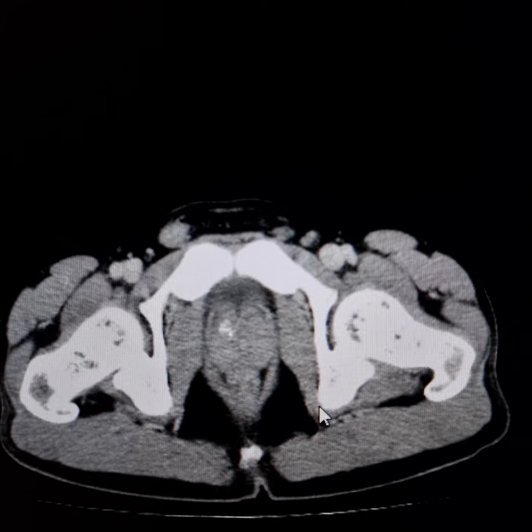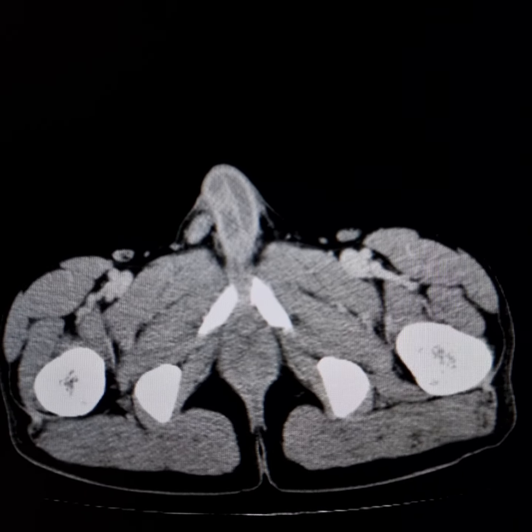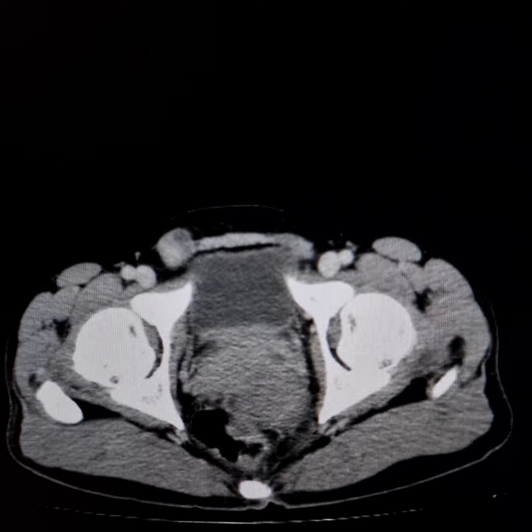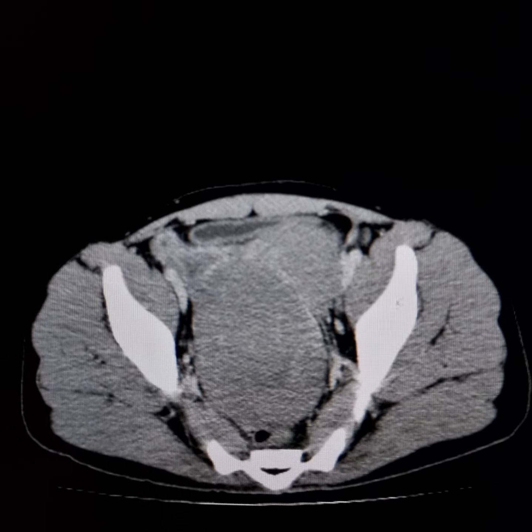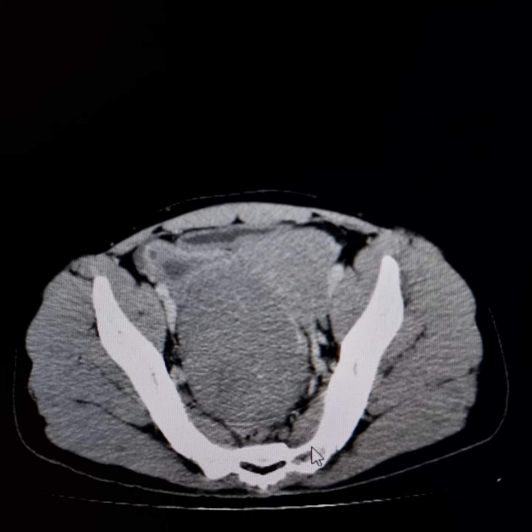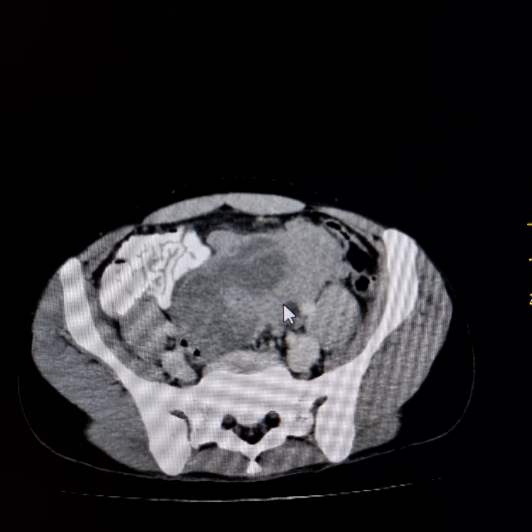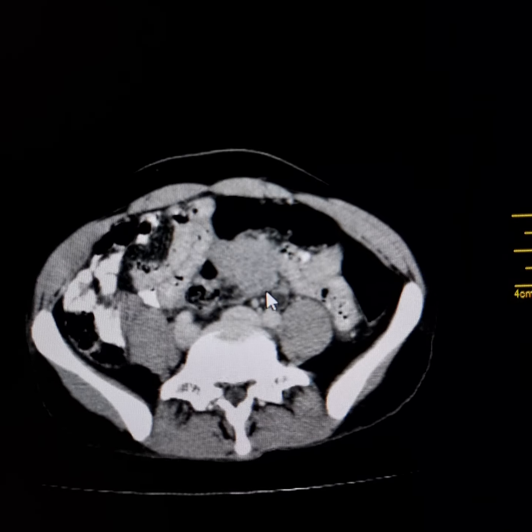But since there is no spermatic cord on the left side, when inquired, it was disclosed by the patient that the patient has got only one testis. So it is a case of seminoma of the left testis. Now this is the enlarged tumorous left testis, seminomatous, and the tumor has infiltrated outside the confines of the left testis into the lower abdomen.